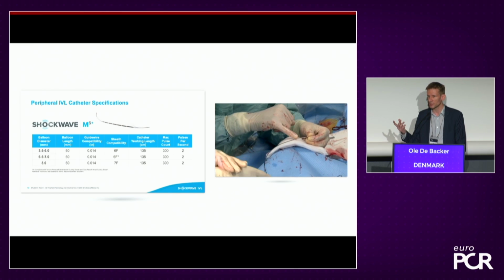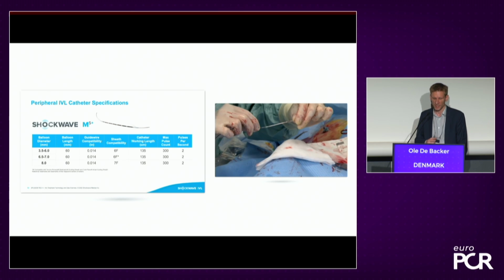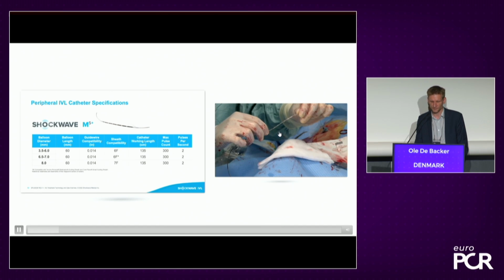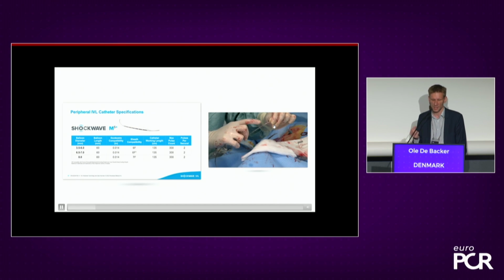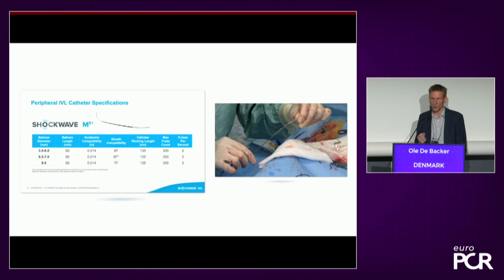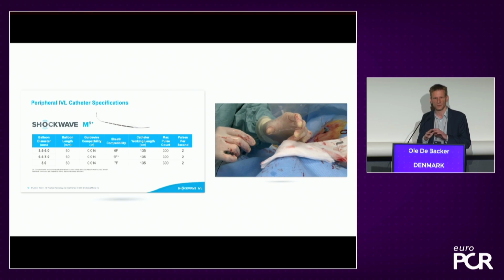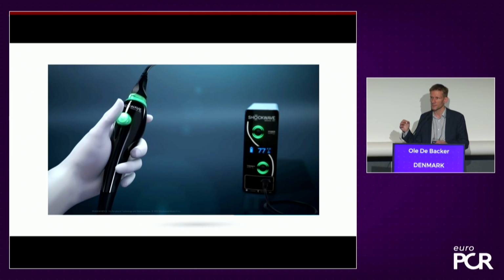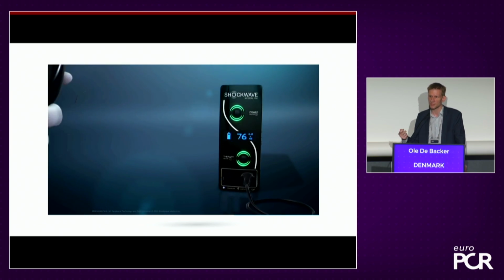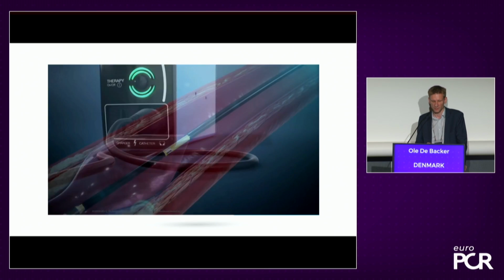You need just a coronary wire, so these peripheral balloons fit on a 0.014 wire. So here I'm showing you the balloon. It's a 6 centimeter long balloon. Personally, I typically use a 7 millimeter balloon of the Shockwave. How to make that choice of 6, 7 or 8? Well, I don't look at the reference vessel diameter, mostly I'm looking at what kind of introducer sheath or size of delivery system I have to push through this iliofemoral axis.